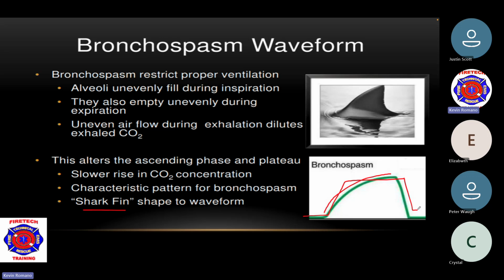That's why it's so important that we get pre and post everything that we do. It's kind of like doing a 12 lead. Before you start popping nitrates into a patient and treating for ACS, you want to get a 12 lead pre and post to know that your medication regimen is working for this patient during transport. Right? If I have nothing to go by, then how do I know it's working? Right? How do I know that's working there?